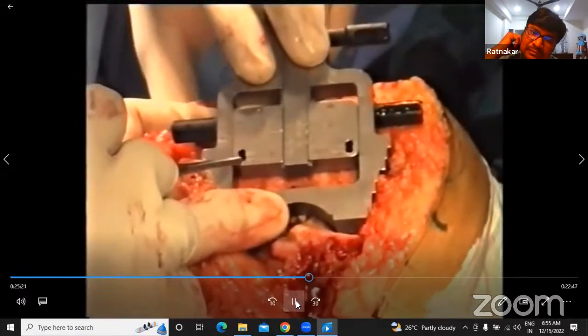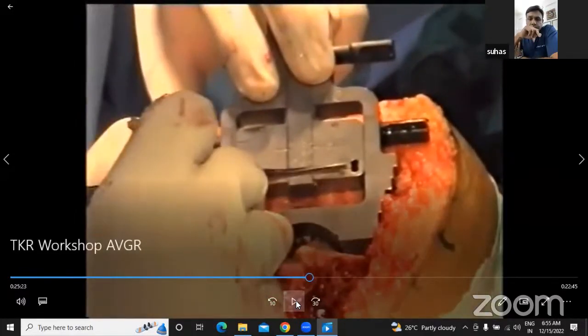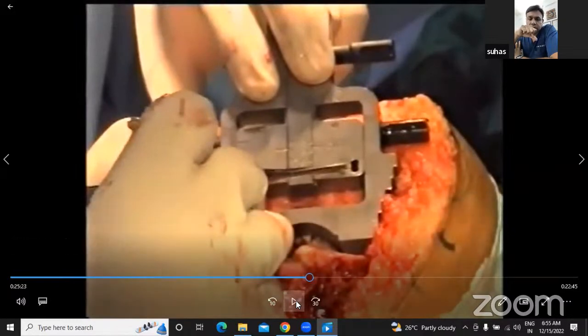If you see closely here, this makes it anterior referencing. Like how we discussed last week, which part of the jig the sizing guide moves decides whether the instrumentation is specific for either anterior referencing or posterior referencing. So we've measured from the top, and as it moves up, we are deciding the amount of bone that is being cut posteriorly.